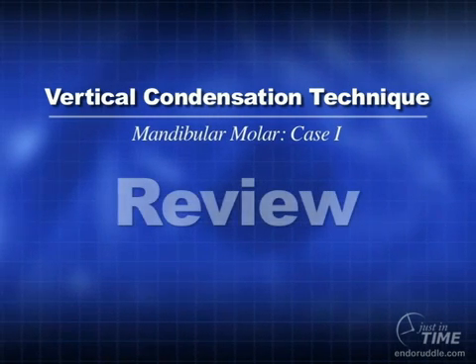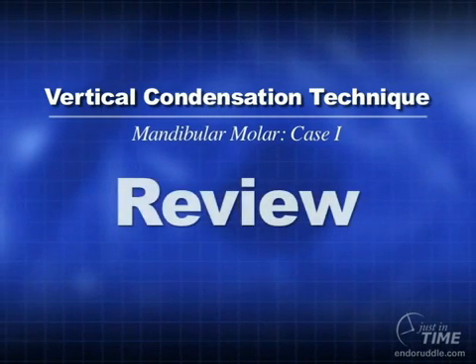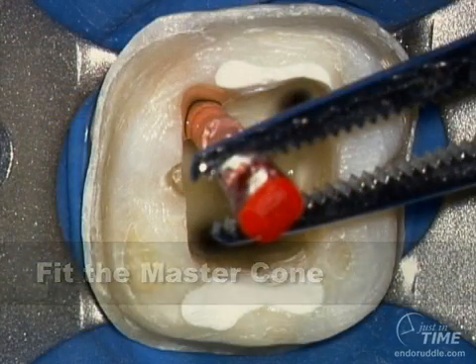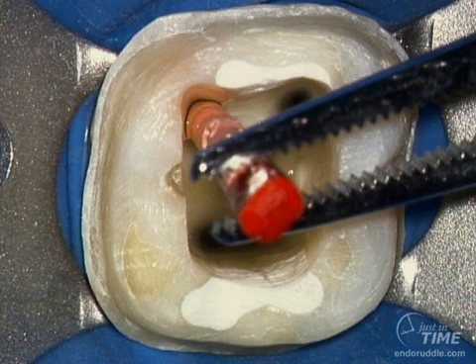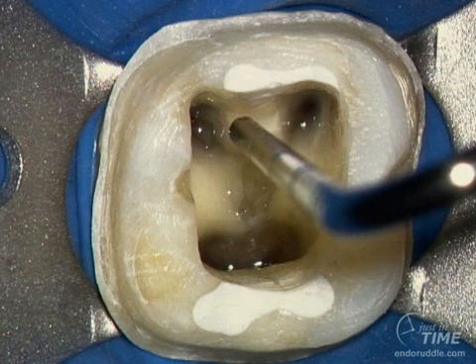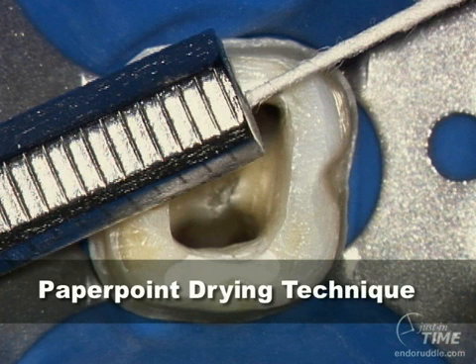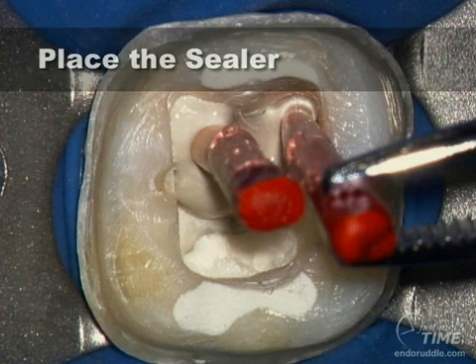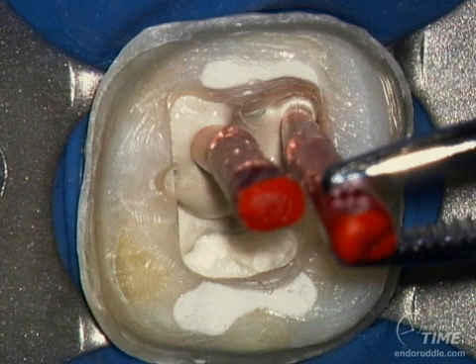Let's review the warm gutta percha with vertical condensation technique. It all starts by having a well-shaped canal. Well-shaped canals allow us to fit a non-standardized master cone of gutta percha. Be sure to size the pluggers and select them so that we can use them safely during the obturation phase. Use paper points to ascertain final working length. Trim the cones accordingly. Mix the sealer, pick it up on a cone, and tease the cone to place, allowing the sealer to reflux safely back into the pulp chamber.